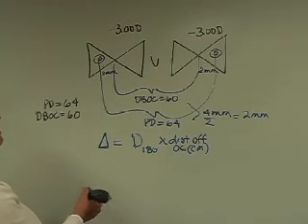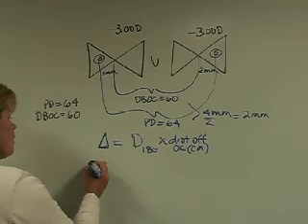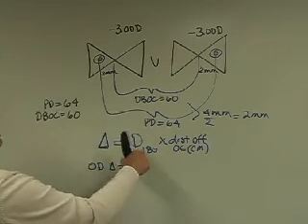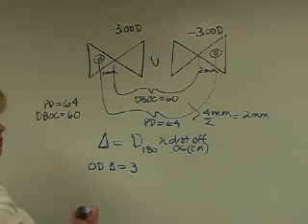And usually we do this calculation for each eye independently because it's pretty rare that one eye has exactly the same lens power as the other. So we'll follow that with this demonstration. If we want to calculate this for the right eye, prism is equal to the diopter power at 180. Since we have a spherical lens, it's just going to be 3 diopters.